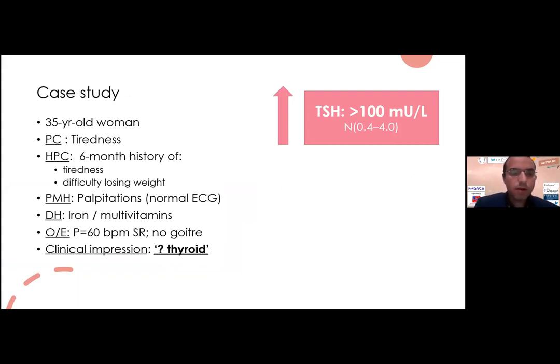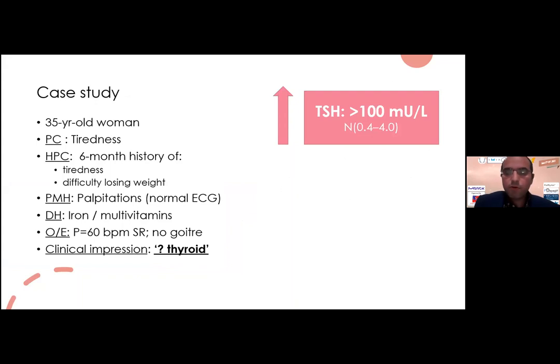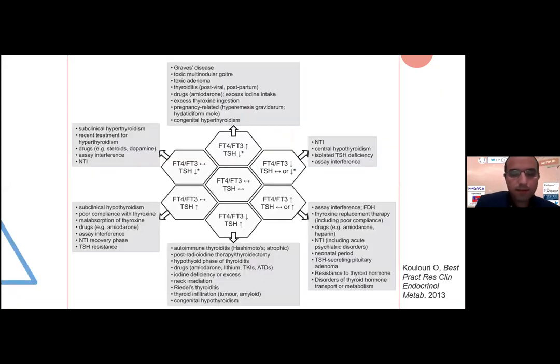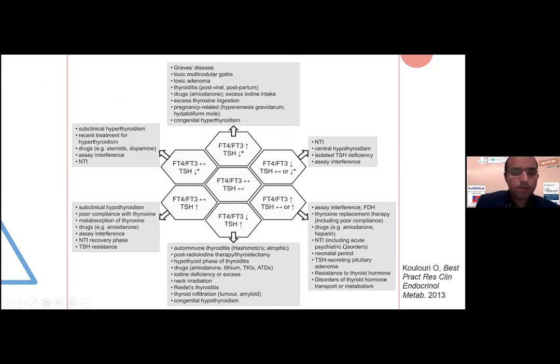She has palpitations, her ECG is normal, she's taking iron and multivitamins. On examination her pulse is 60 beats per minute and she has no goiter. The general practitioner sent the patient with a clinical impression of something with the thyroid. Surprisingly, her TSH was more than 100, and more surprisingly, at this very high TSH her FT4 was normal — 17 pmol per liter. This places her in the pattern of normal FT4 and FT3 with very high TSH: subclinical hypothyroidism or assay interference.